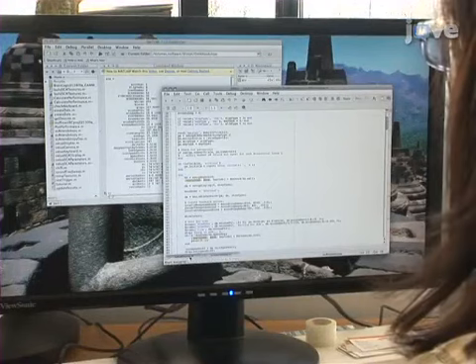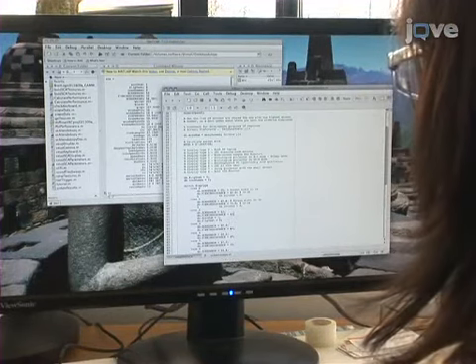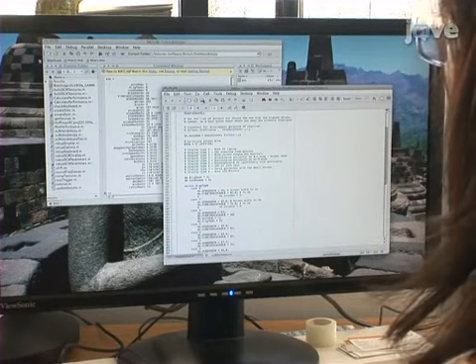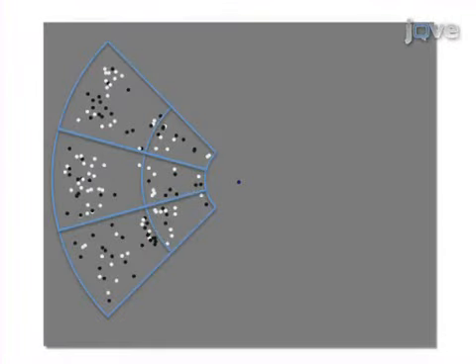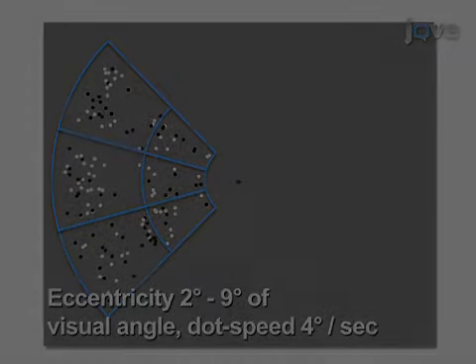To obtain a polar angle retinotopic map in the superior colliculus, first set up a functional paradigm using a 90-degree wedge of moving dots as the stimulus. The stimulus is divided into 2 by 3 virtual sectors, with dots in one of the sectors randomly chosen.